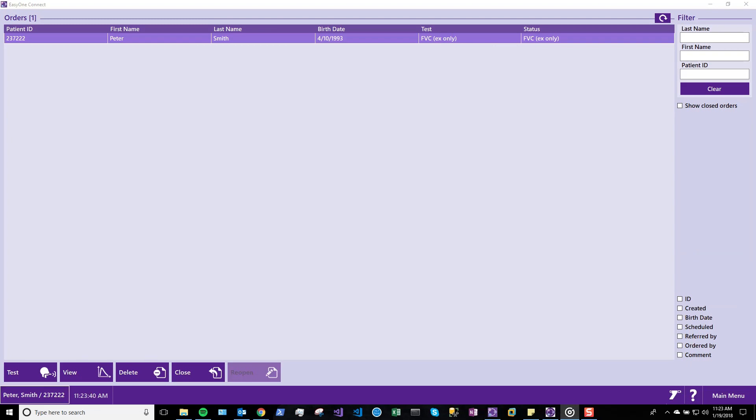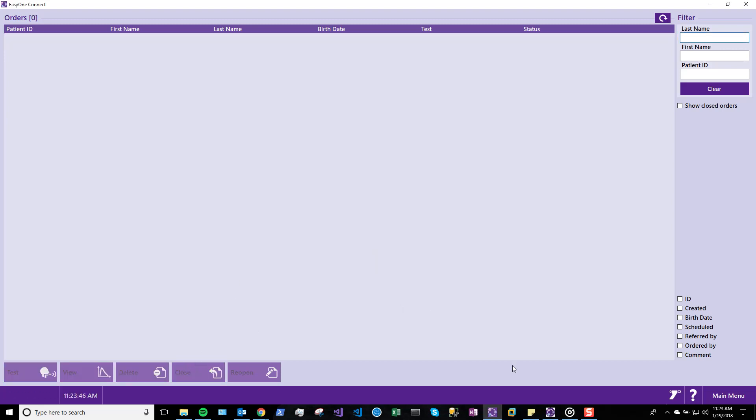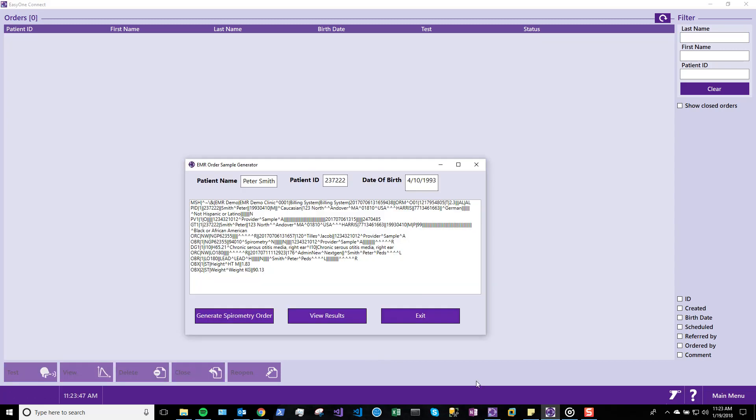Once testing is complete, closing the order transfers the result to the EMR. We will review this report as it appears.